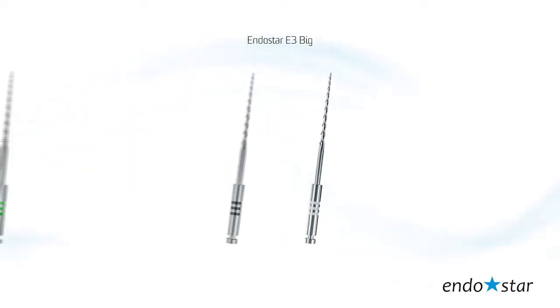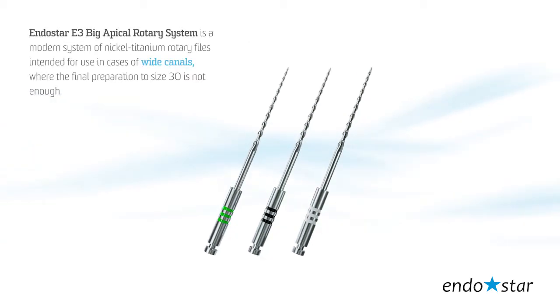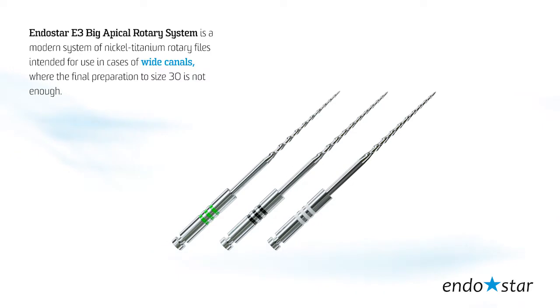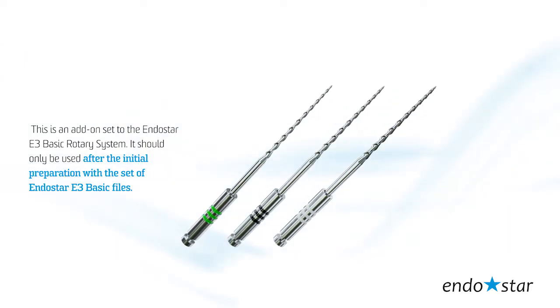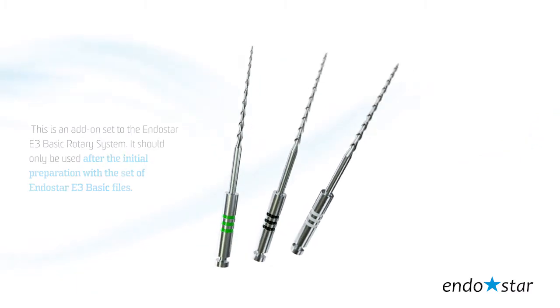The EndoStar E3 Big Apical Rotary System is a modern system of nickel-titanium rotary files intended for use in cases of wide canals where the final preparation to size 30 is not enough. This is an add-on set to the EndoStar E3 Basic Rotary System, and should only be used after the initial preparation with the set of EndoStar E3 Basic files.